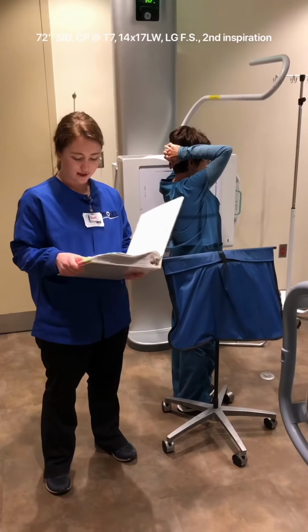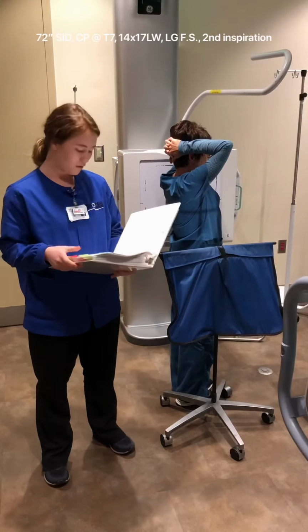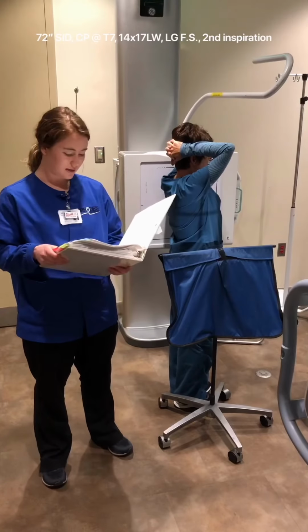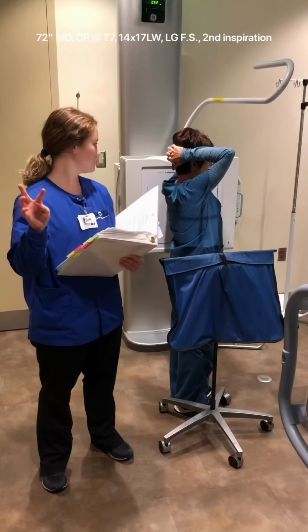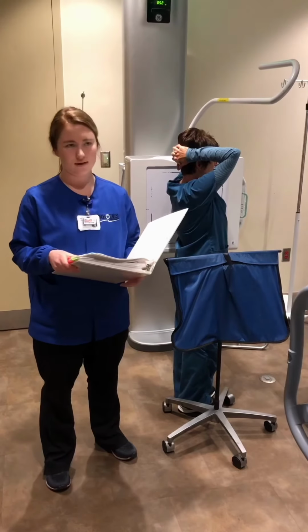Once again, tell her to take a deep breath in, blow it out, take another deep breath in, hold your breath, and then she can breathe. If they're using AEC, make sure you use the right and left chambers for the PA, and then the center chamber for the lateral.